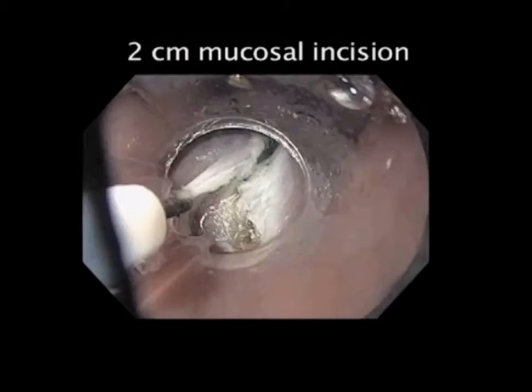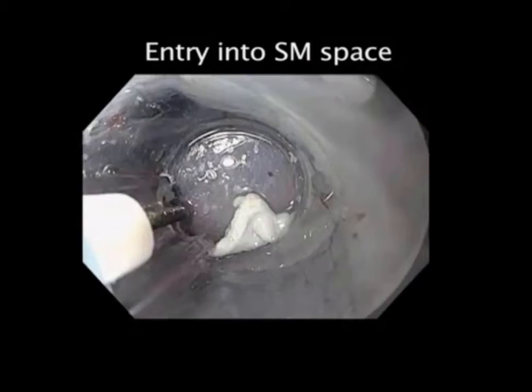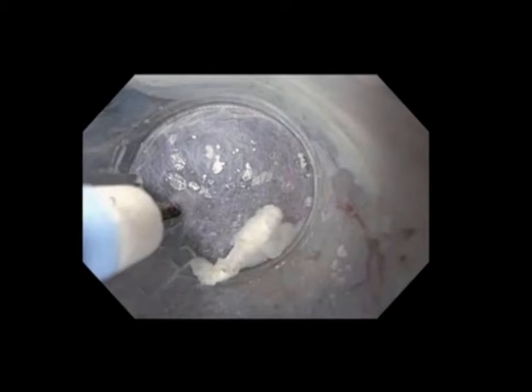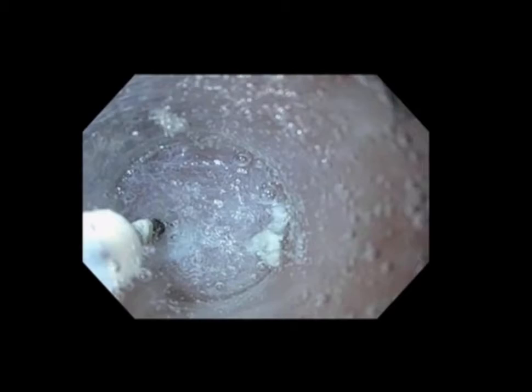At this point, we switch off the CO2. We enter into the tunnel and infuse water for our underwater dissection. We apply the tip of the hybrid knife to the interconnective tissues, intermittently injecting to enhance the submucosal space, and we identify the muscularis propria layer, which is well identified by its white color at the base.